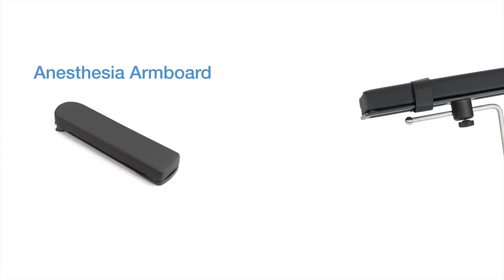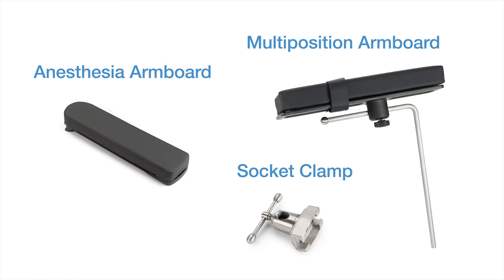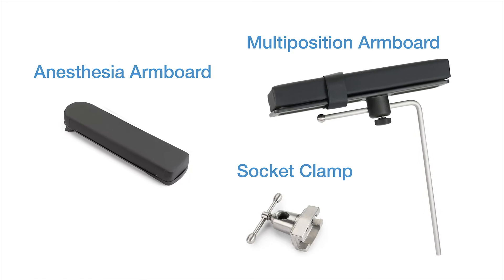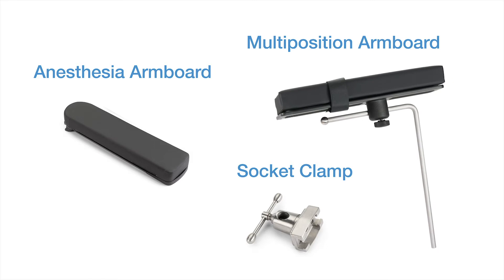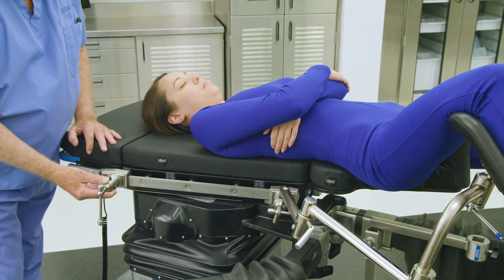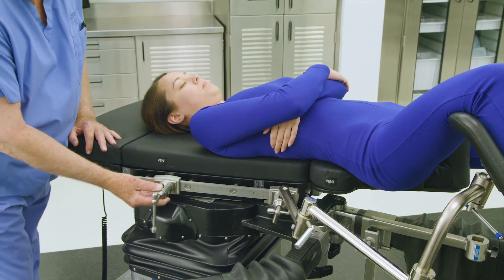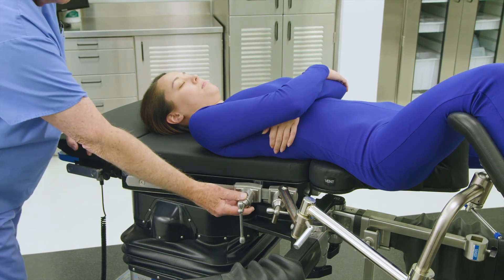The OT-1000 series table is equipped with both an anesthesia arm board to help position the arm on the non-operative side of the body and a multi-position arm board to help position the arm on the operative side, to ensure patient arms are properly positioned during the procedure. Before attaching an anesthesia arm board, first apply a socket clamp to the side rail on the non-operative side of the table.